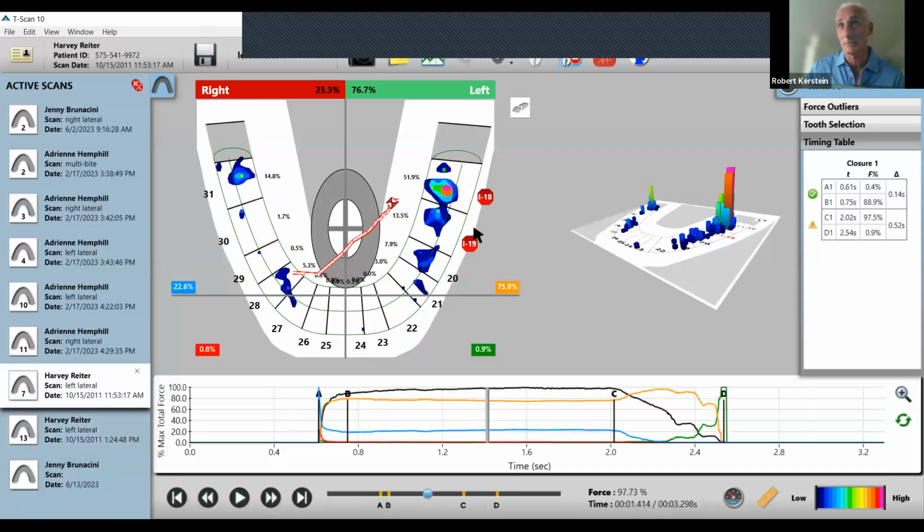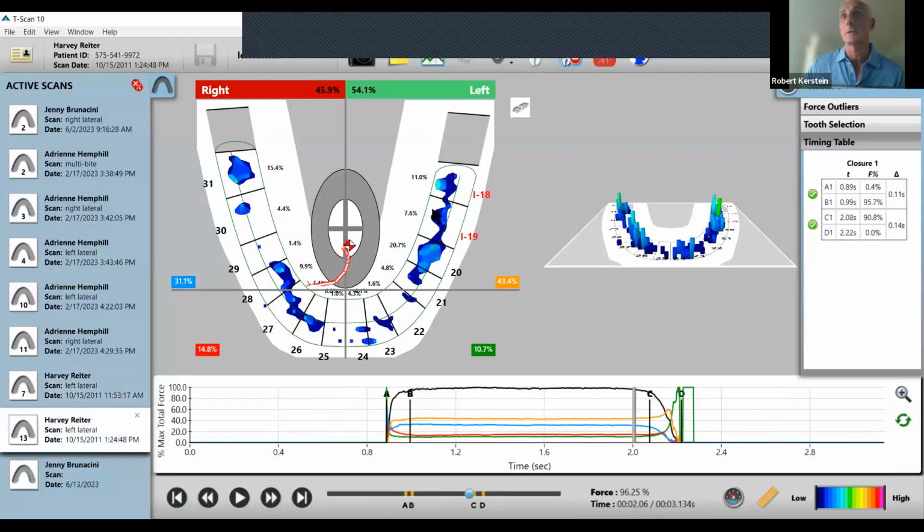See, these implants are under overload warning. That's another great T-Scan software feature, right? Now, after correcting the implants in closure and excursion, we have no more warnings, which is perfect. Now, how long are the implants involved in this excursion, the postoperative excursion, which lasts 0.14 seconds? Well, we do the same thing.